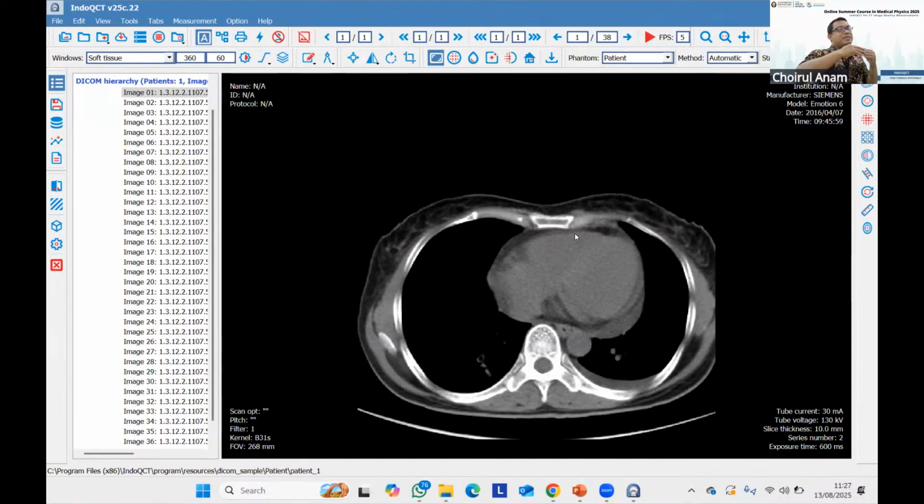The image looks like a sawtooth. So if you want to get a very good image in the sagittal or coronal planes, it is important to have a very thin slice thickness. If you make the interpolation calculation, there is only a little data. If your slice thickness is very thick, the interpolation is not good enough. Okay, that is the problem.